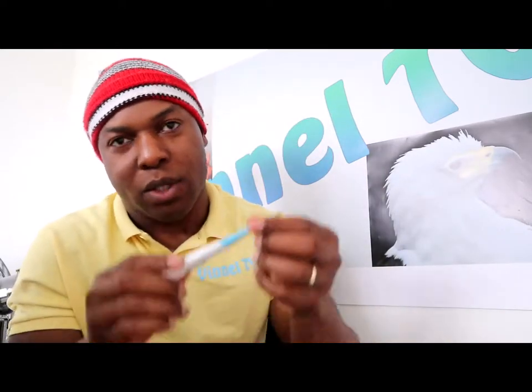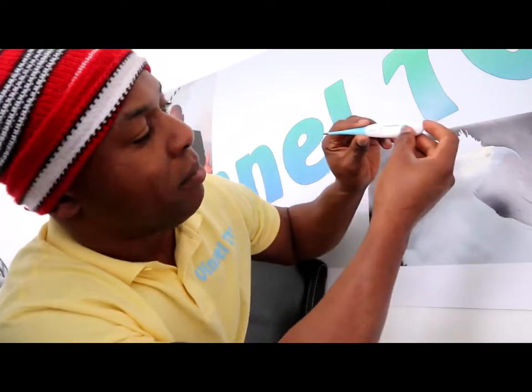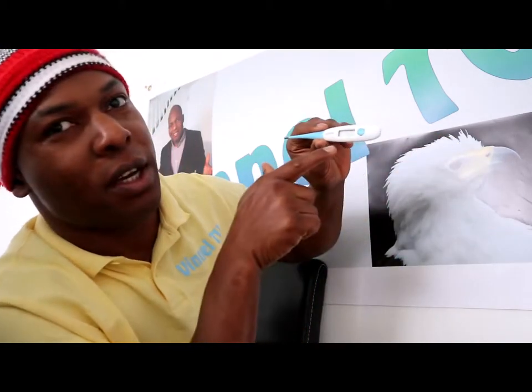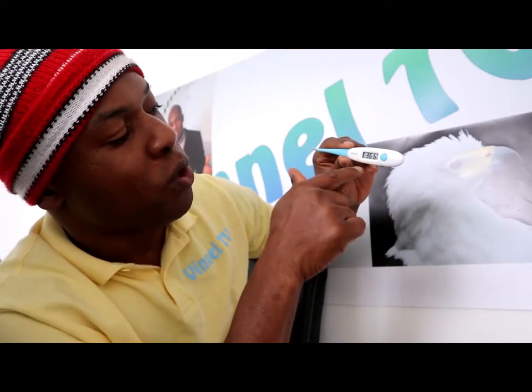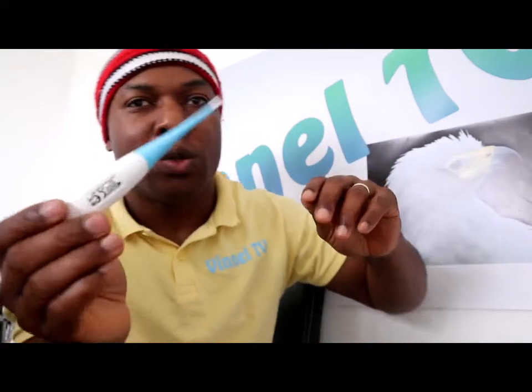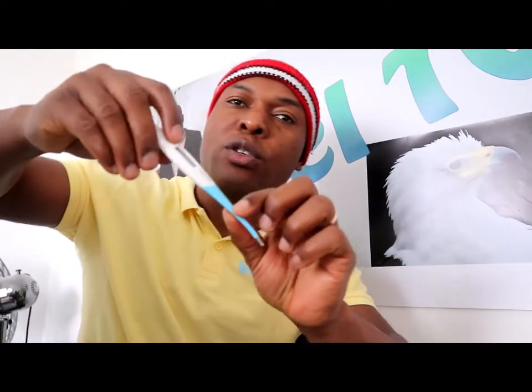Okay, the other way to do this, I want to show you the other way to do this. To turn this off, you need to press the blue button. Now it's off. To put it back on, you press the blue button again, it will show. Now what we want to do is to show you how you can measure this underneath your armpit. The same procedure, you need to press the blue button and put it underneath your armpit and close it. Once you hear the beep sound, then you know that it has taken your core body temperature.